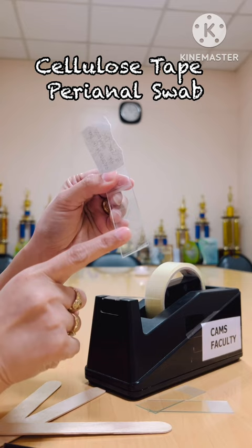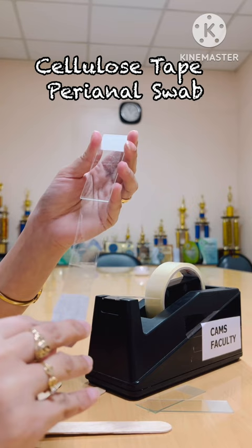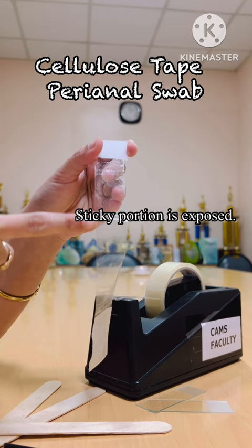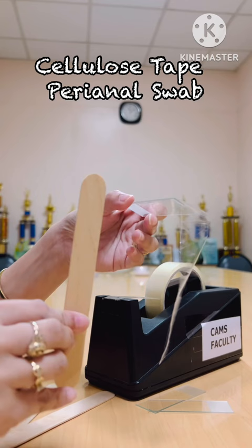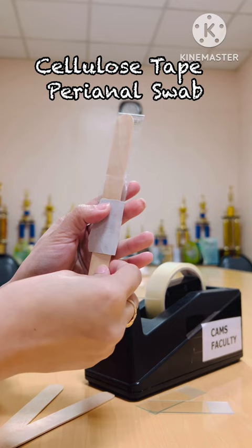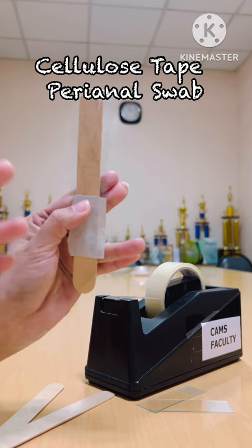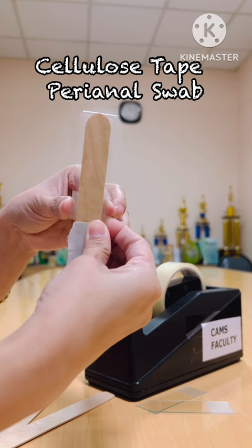Remember that we have placed three-fourths on the back and the entire edge on the front. We'll remove it completely, and as you can see it will stop here — so the sticky portion is this area. Then we will place our tongue depressor at the back. The tongue depressor is situated at the back of the slide and the sticky portion is facing outside — this is where we will be collecting the sample in the perianal region of our patient.